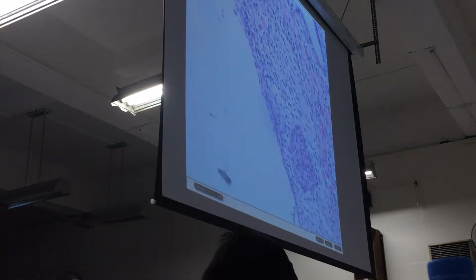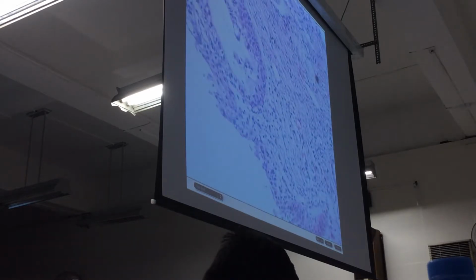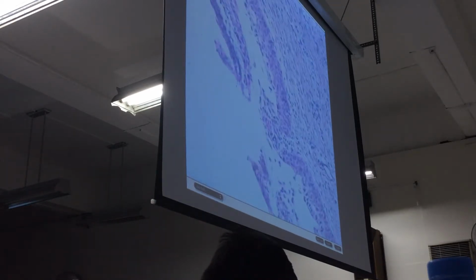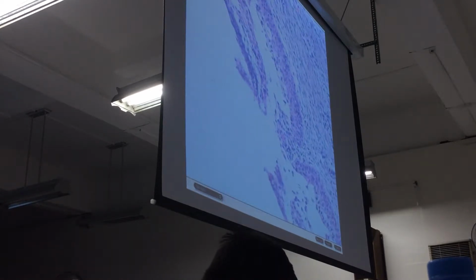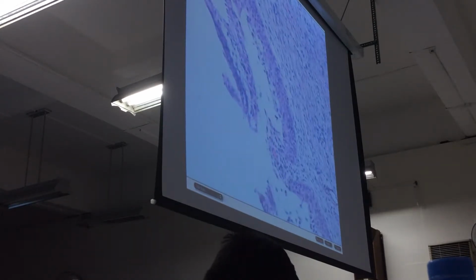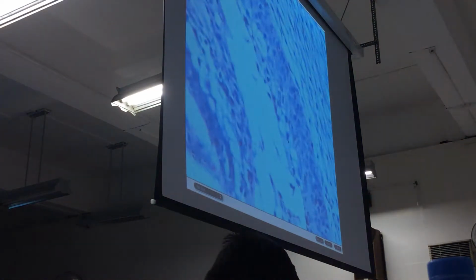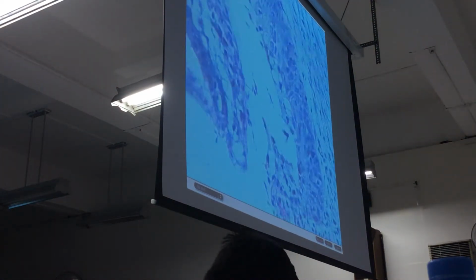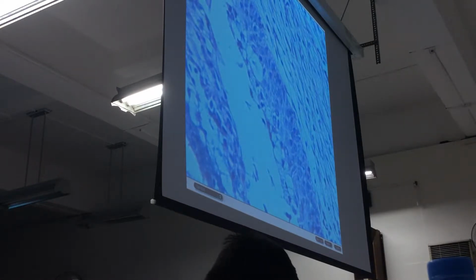First, the basal cells of the endocervical epithelium will decide not to become endocervical cells and instead multiply themselves. Thus, you have what you call reserve cell hyperplasia, and this is seen on the screen right now.